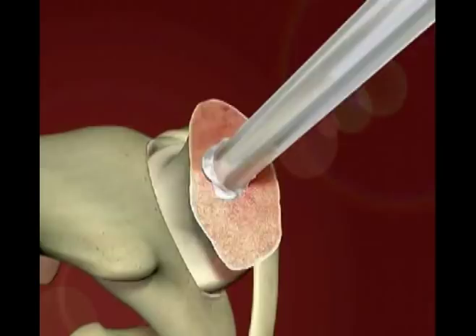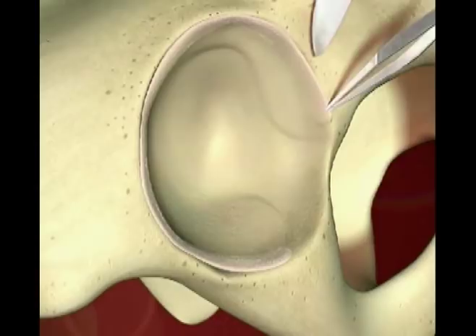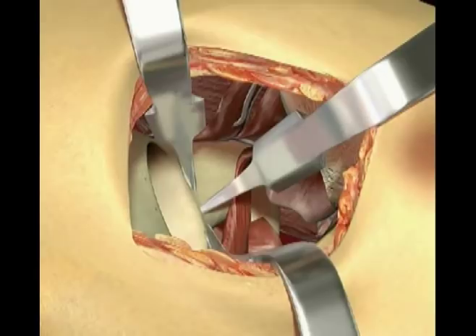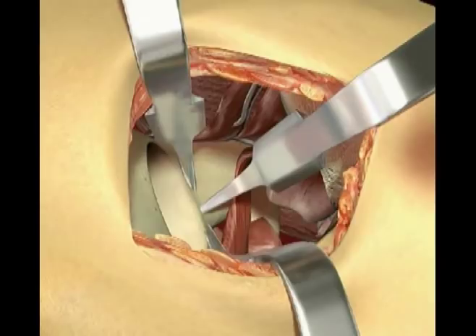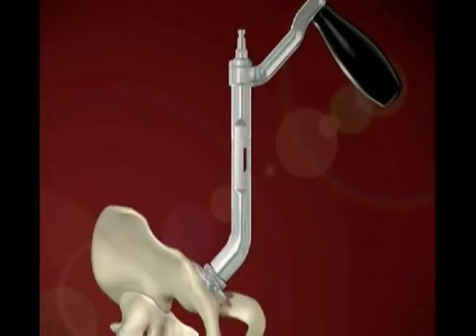Once the head has been resected and extracted from the wound, turn to the acetabulum and remove any remaining labrum. Put a third double-bent retractor beneath the femur and move the femur distally to provide good visualisation for acetabular and femoral reaming. Using the smallest reamer attached to the 45-degree driver introduced perpendicular to the table, ream the acetabulum holding close to the transverse ligament. Once the acetabulum has been deepened to the level determined during preoperative templating, the reamer size is sequentially increased in 1–2 mm increments.